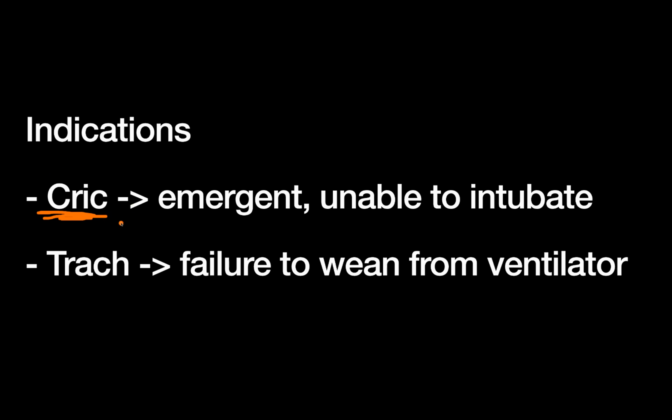However, the problem with the cric is that it's relatively high in the neck and high in the trachea, where it's a little bit narrower, and long-term use of a cric could potentially lead to some stenosis of the trachea itself. So once a cric is placed, you're usually thinking about converting it over to a trach within 24 to 72 hours is the common teaching.